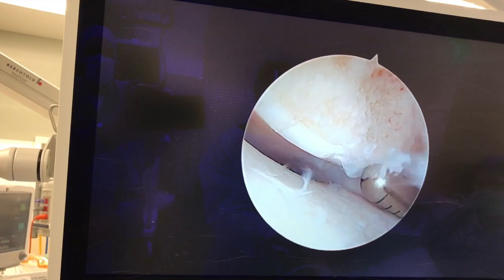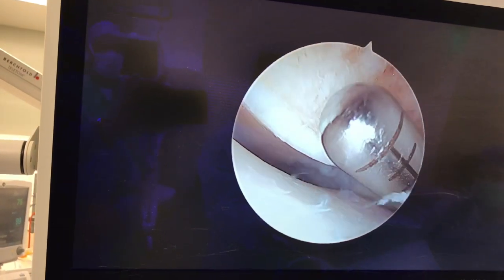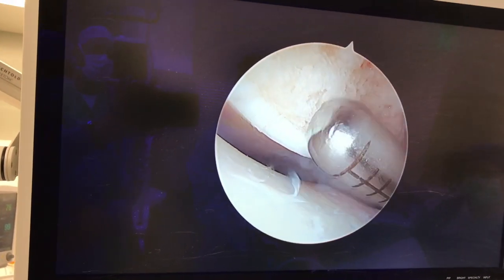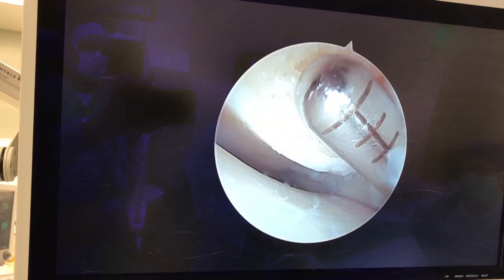There we go. So all that cartilage is trimmed down, and I can finish off the bone here — you can see that right closely. It's still fracturing, it's still a little detached right there, so I'll continue to eat away at this.